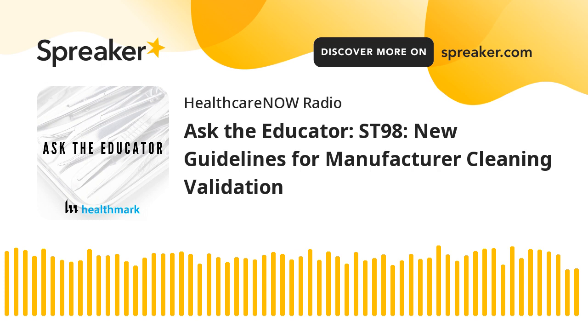That's a great distinction there. So worst case is the worst case in what you'd expect in normal or clinical use. And it is a gray area. I think the device manufacturer ultimately has to justify why they've defined worst case the way they have, but it's based upon the clinical use of the device. It's a little bit easier when we talk about cleaning, because you just talk about the lowest concentration or the lowest temperature or those kinds of things. But it's a gray area, and it's really important, as I mentioned in the webinar.